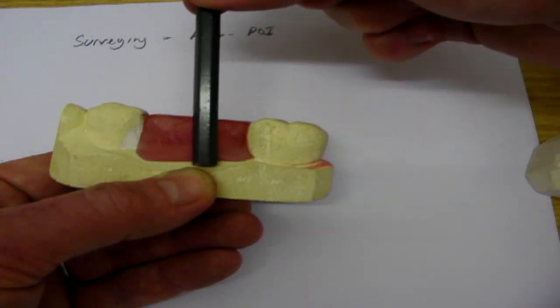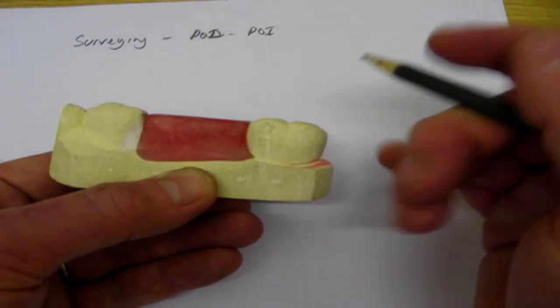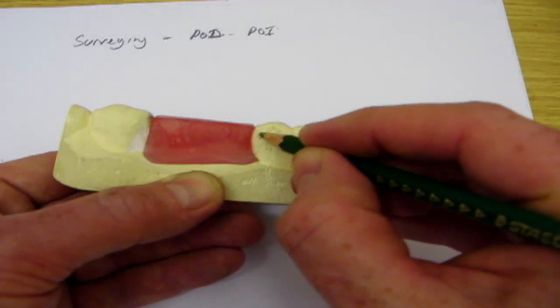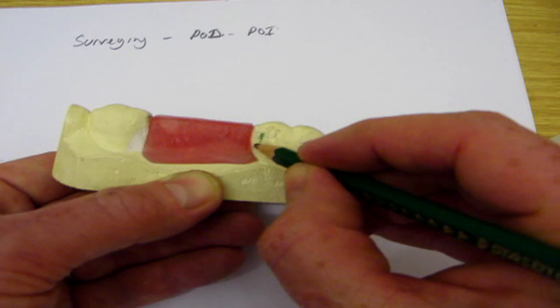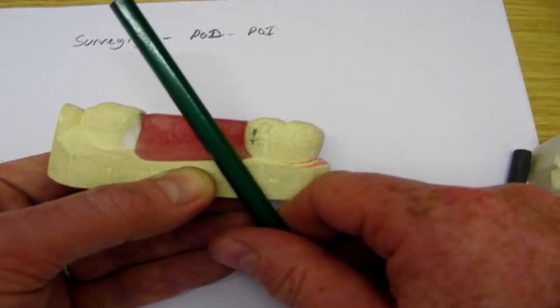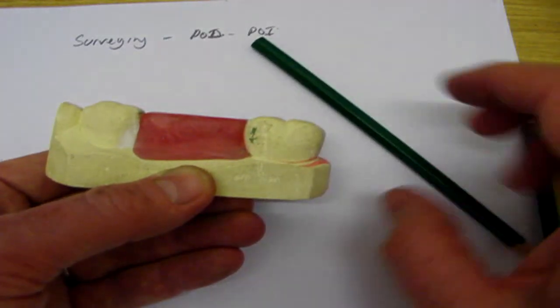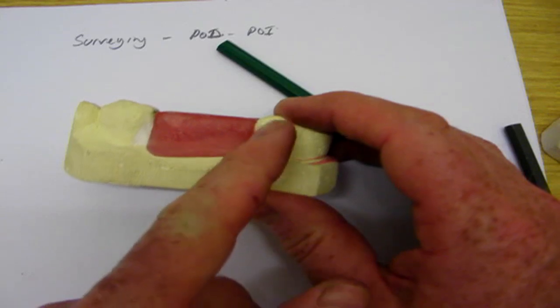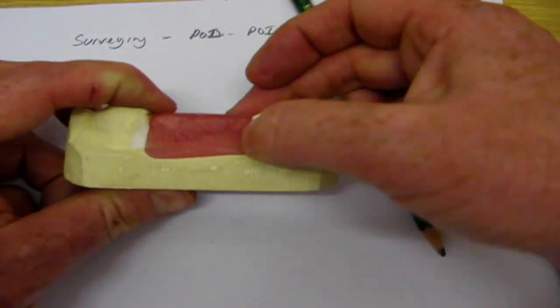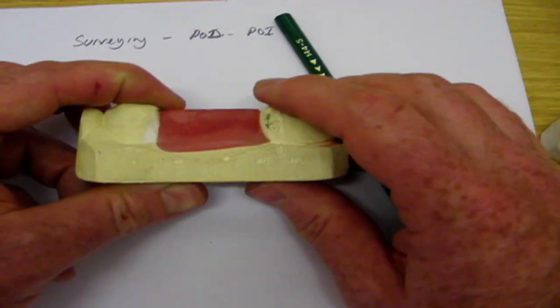So relative to the path of displacement, we've gained some retention on this molar tooth. We haven't gained any retention relative to the path of insertion, just this path of displacement. So now we've got mechanical retention by engaging that undercut with the body of the denture, and that's going to create some retention for our denture, which is going to be permanent.